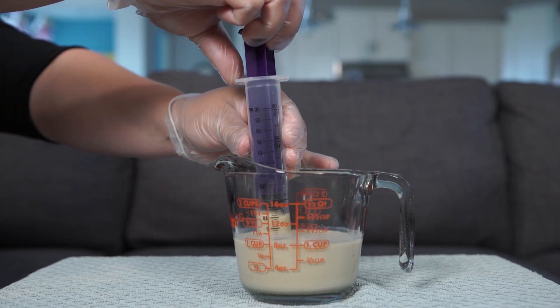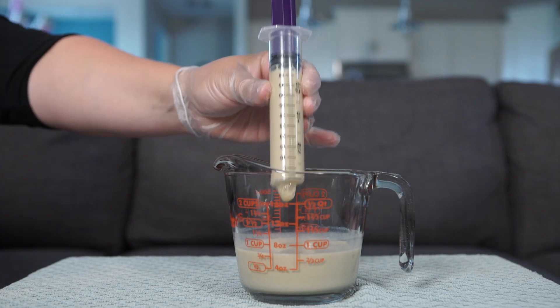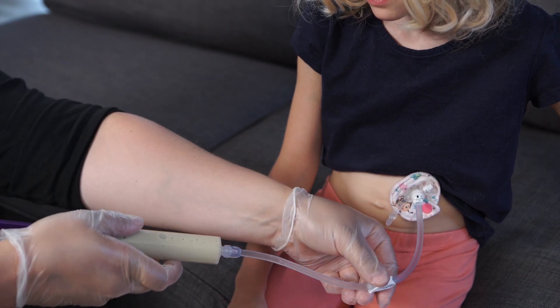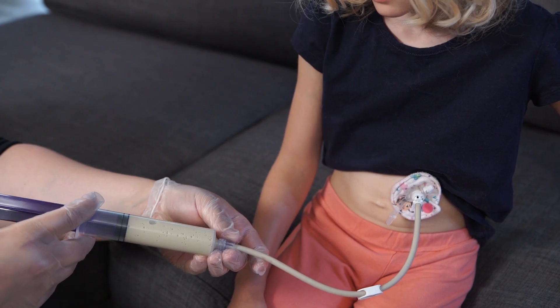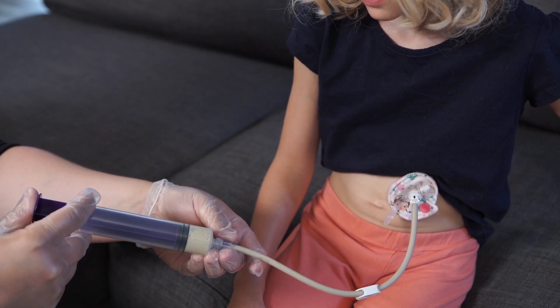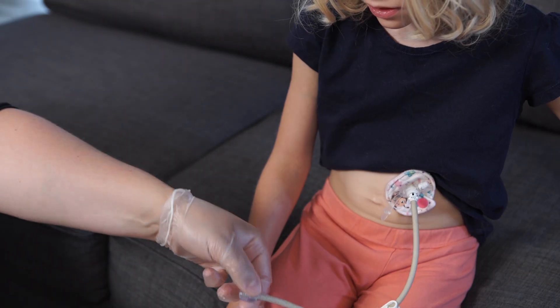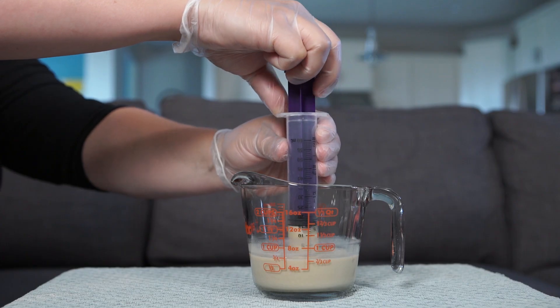Pull formula from the measuring container into the large syringe. Attach the syringe to the feeding tube or extension. Open any clamps on the feeding tube and extension. Slowly push the plunger until you empty the syringe of formula. Clamp the feeding tube and remove the syringe. Repeat these steps until you give the prescribed amount of formula for the feeding.